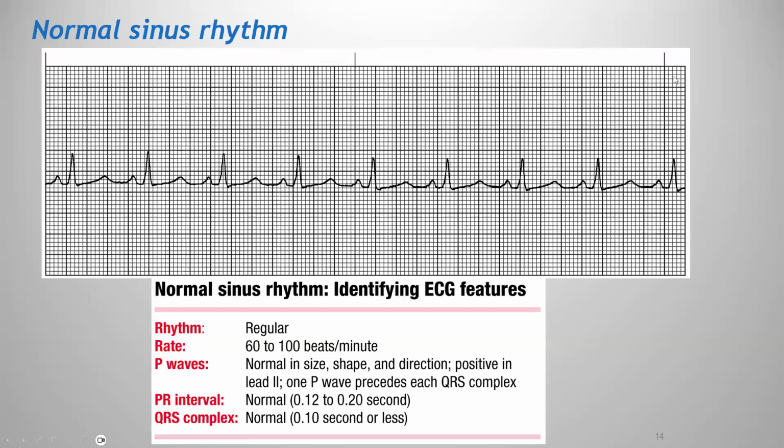Now, see, this is outside of the line already. You should not count this because you're only timing it for 6 seconds. So you say 1, 2, 3, 4, 5, 6, 7, 8 times 10. That would be 80.